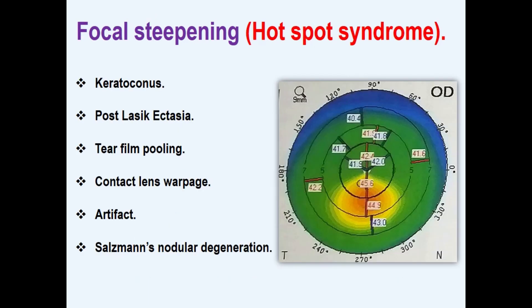What is the hot spot syndrome? It is an area of relatively high power on the axial curvature map. Hot means hot colors, and it may be associated with other topographic or corneal abnormalities. The differential diagnosis includes ectatic and non-ectatic causes.